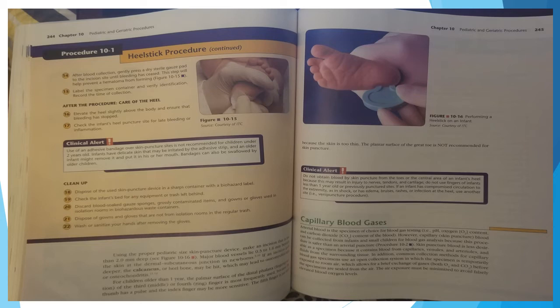Label the specimen container and verify identification. Record the time of collection. After the procedure, care of the heel. Elevate the heel slightly above the body and ensure that bleeding is stopped. Check the infant's heel puncture site for late bleeding or inflammation.